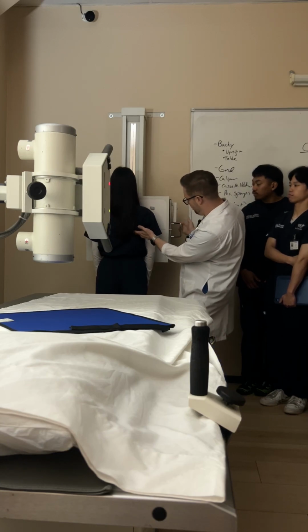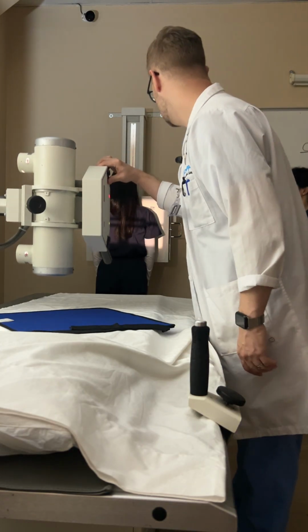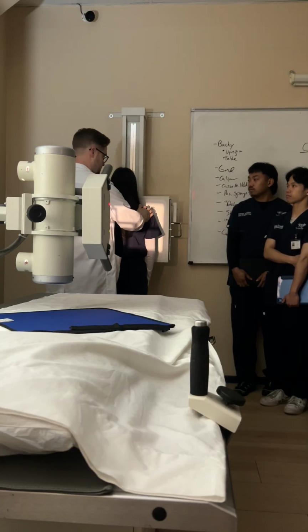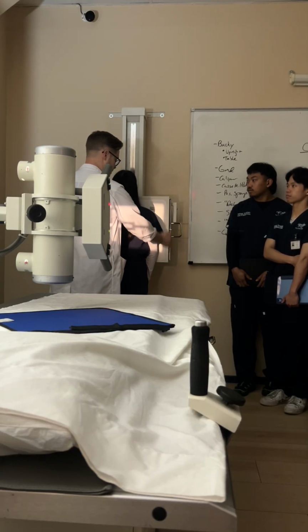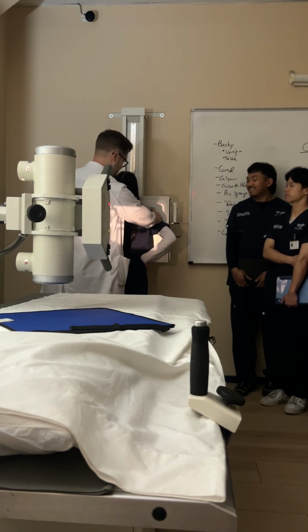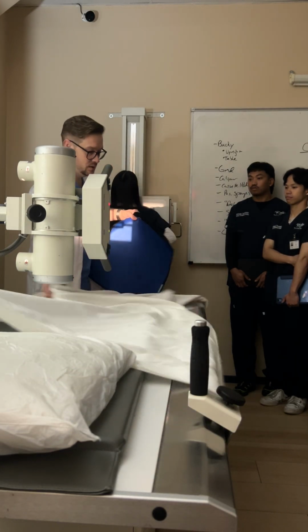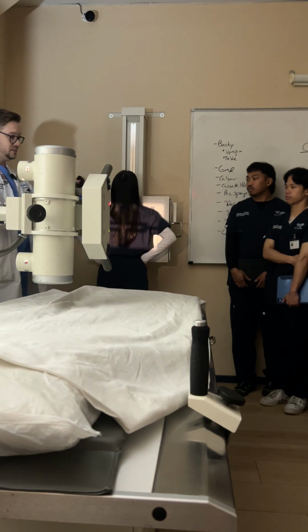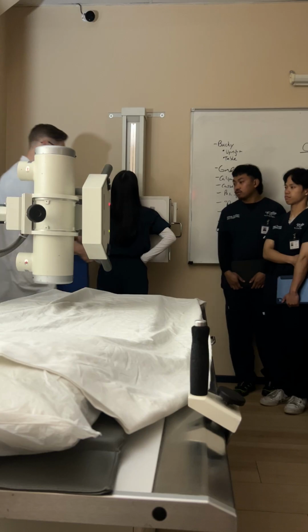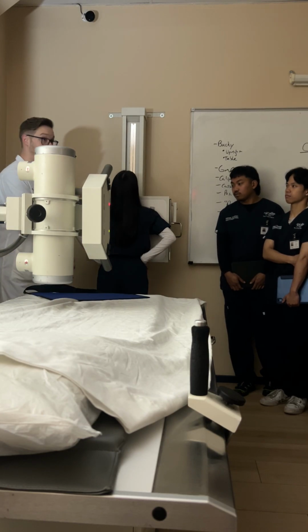Okay? And then boom. Okay? Now you're going to feel me put my hands on your shoulders. Okay? Roll those shoulders forward. Put the backs of your hands on your hips. Great. Roll those shoulders forward. Great. We did not have her do this beforehand. Most of the time, too, these lead shields will have kind of what's called a tension band on them, so they're very easy for you to pull open and just go, beep. Okay? So for our purposes right now, we did put a shield on her.